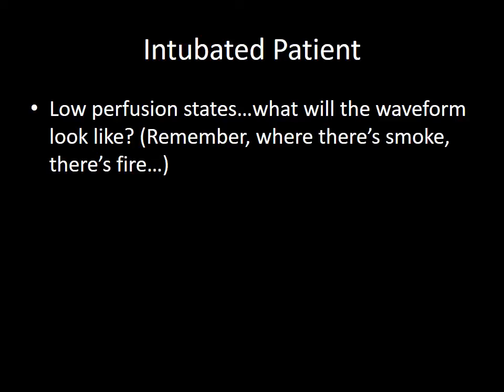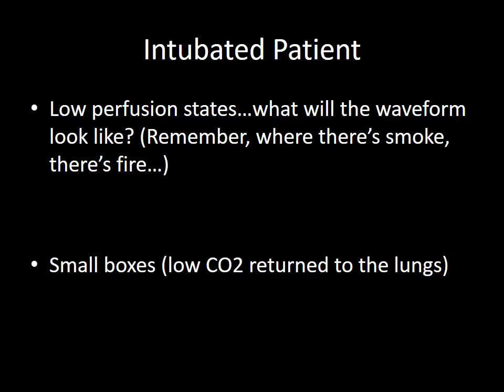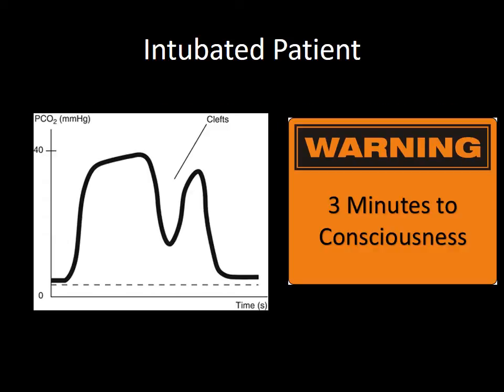Remember, low perfusion states, the waveform will be small. Small boxes means small CO2 return. You start to see these cleft waves in an intubated patient. That means they are becoming less sedated and starting to breathe over the tube.